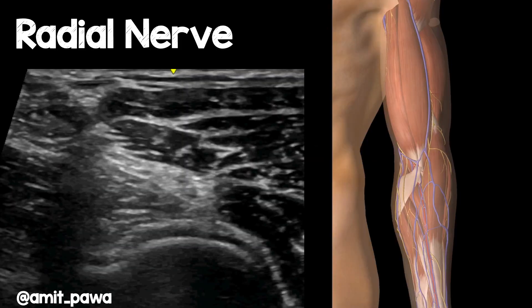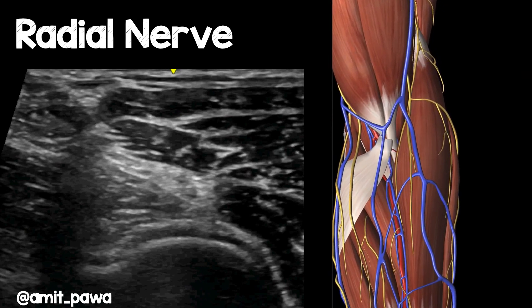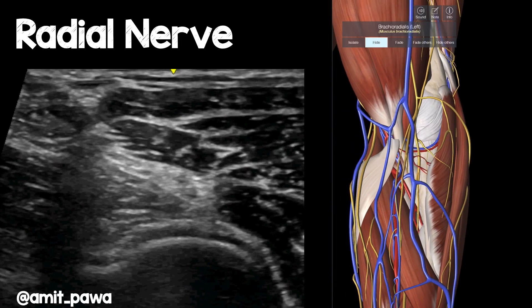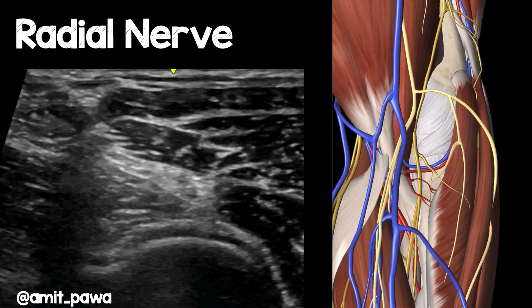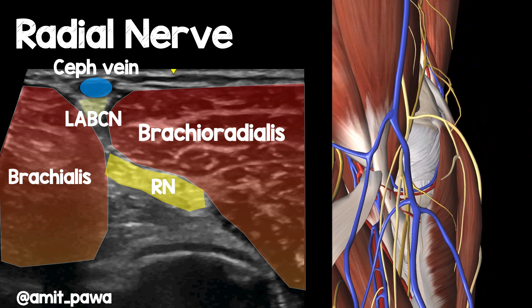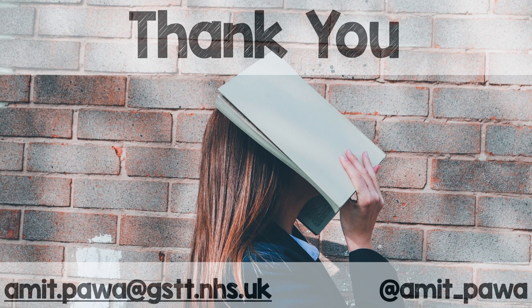Finally, the radial nerve. I tend to start scanning at the antecubital fossa, where you can see these classical muscles and the typical appearance. Highlight the cephalic vein, then brachioradialis. Remove brachioradialis and you'll see deep to that, brachialis medially. The radial nerve lies right near those two muscles, sandwiched between them effectively. On top of those muscles, you can then see the lateral antebrachial cutaneous nerve. So you've got the cephalic vein, brachioradialis laterally, brachialis medially, and the radial nerve sandwiched between them. The best thing for you to do now is pick up an ultrasound and start scanning yourself to see if all of this makes sense. Thank you very much for your time — I hope you found this useful.